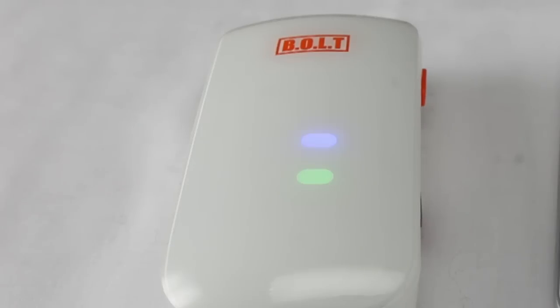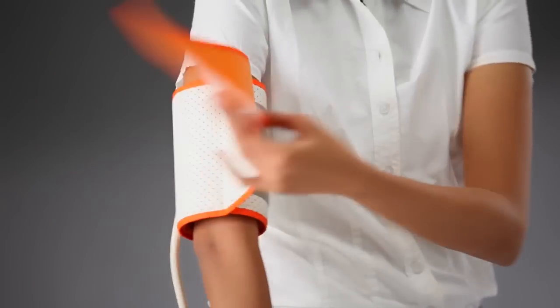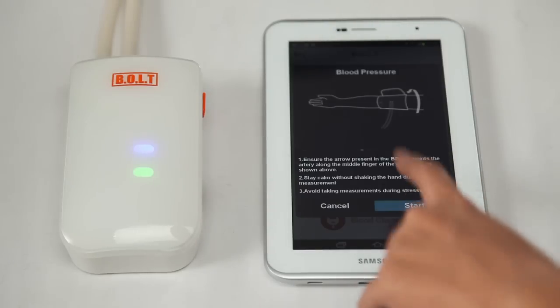Once this device is paired, the blinking stops and voila, it is ready to check your health status. Position the Bolt cuff on your upper right arm, about 1 inch or 2 cm above your elbow. Rest your arm on a flat surface and relax by clicking on the start button in the app.